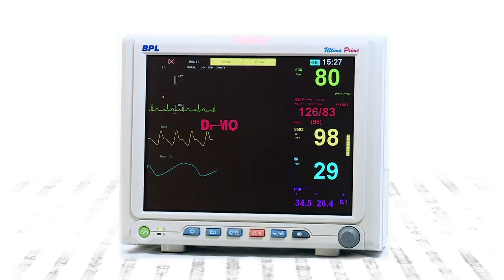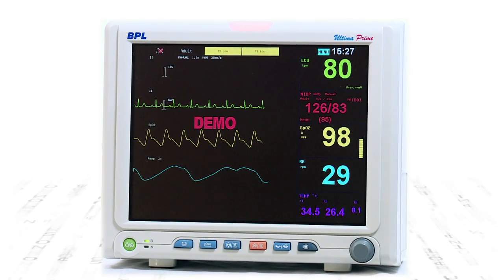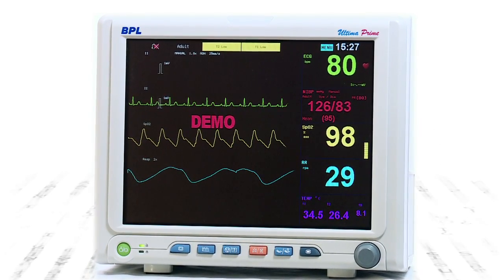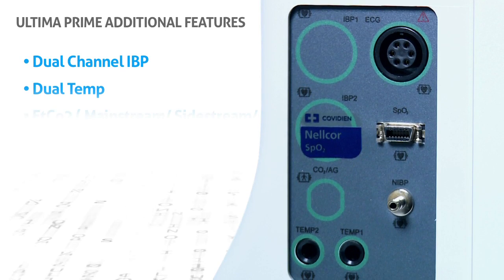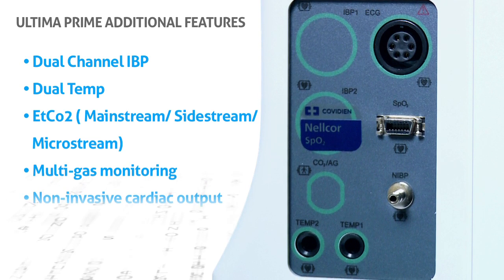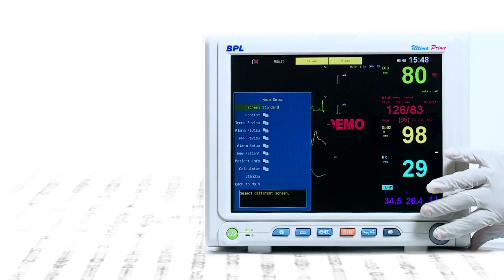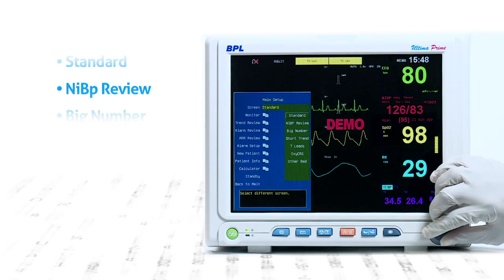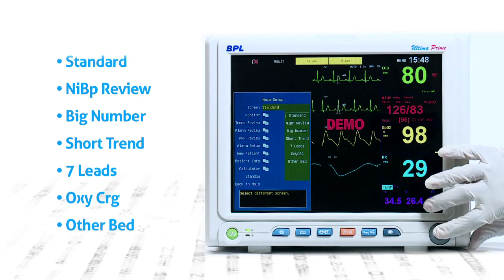Ultima Prime series of monitors is the one-stop option for your complete critical care and emergency monitoring. Different screen layout options are available on Ultima Prime, allowing the user to choose from a number of options.